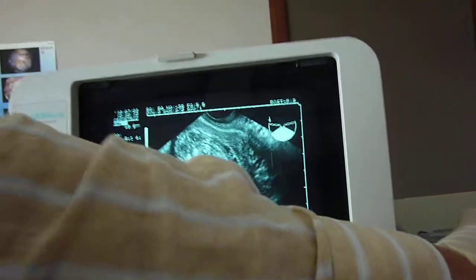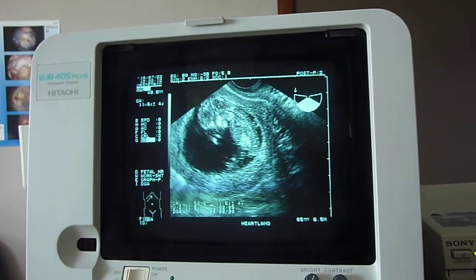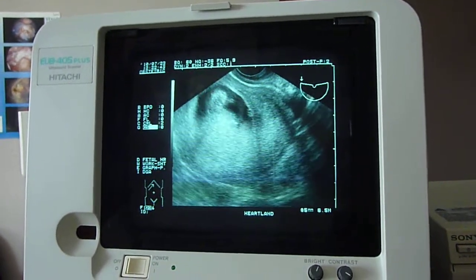So I'm going to take another picture. Do you have a crown measurement there? It's almost 50 millimeters — 49.6 — so 50 would be... it's 12 weeks plus or minus 4 days.